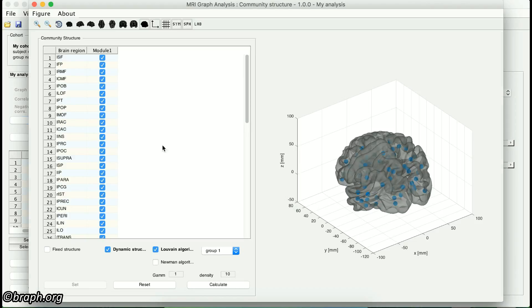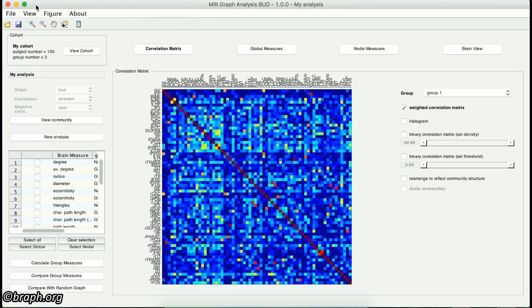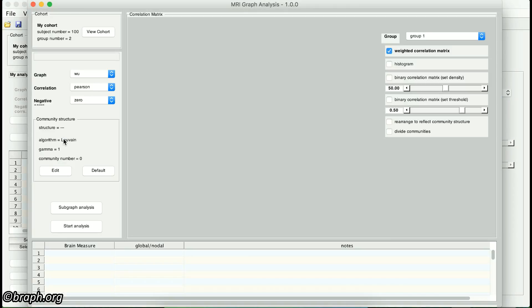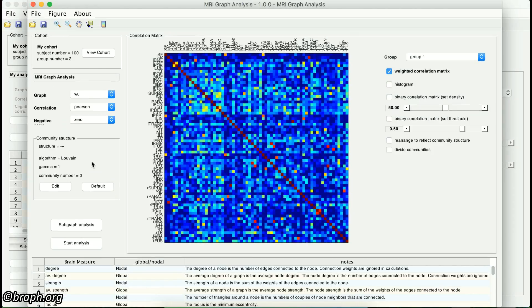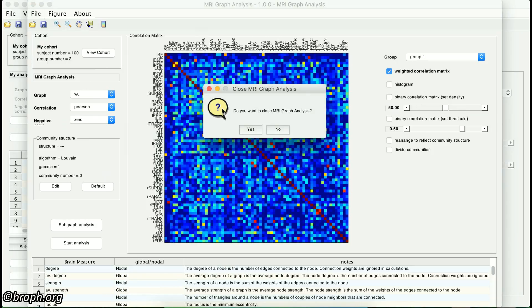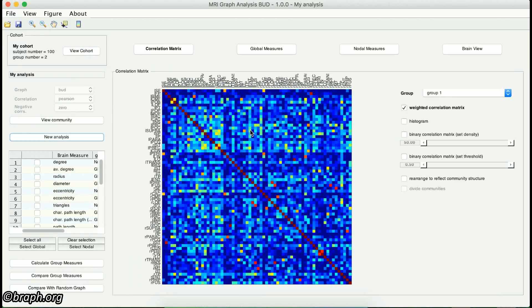Remember that you cannot redefine a new community structure for your analysis here, but you can visualize it. In the case that you want to modify any of these parameters, you have to click on the New Analysis button, which will take you to the previous interface where you can redefine the analysis parameters. On the main panel, you can see the same tools for visualization of the connectivity matrices as in the previous interface.